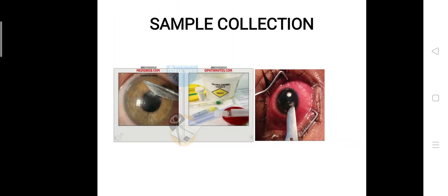Now you have to transfer the specimen to the plate, spreading the material throughout the agar. If you are also preparing a slide, you have to place the specimen on the slide first and then the plate. When preparing this plate, you have to avoid breaking the surface of the solid agar. It is convention that a corneal specimen is drawn on the plate in the shape of a C. However, this is not necessary as long as the plate is clearly labeled as corneal culture.